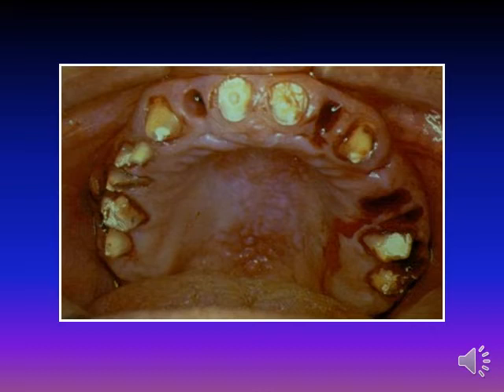This reduction is only an approximation. After a suitable interval, when wound healing is complete, the teeth are given their final contouring, coping fabricated if indicated, and the appliance either refitted or remade. The various techniques for preparation of the abutment. Number one, simple tooth modification and reduction.